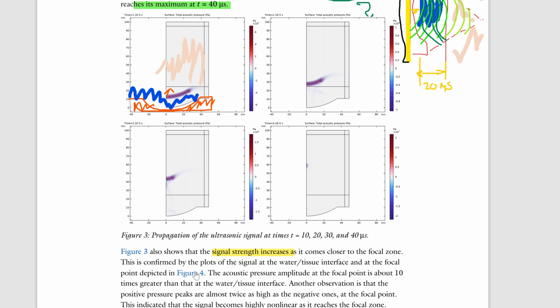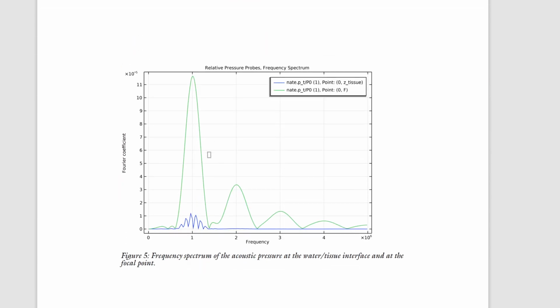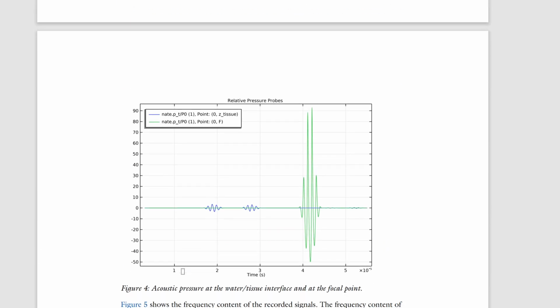So we got ahead of ourselves. Let's take a sneak peek. Let's find these figures. Figure 5. Here we go. What do we have on here? What are the units? So we have time. Relative pressure probes. Must be pressure. Don't know the units, but see here? Look at that pressure.